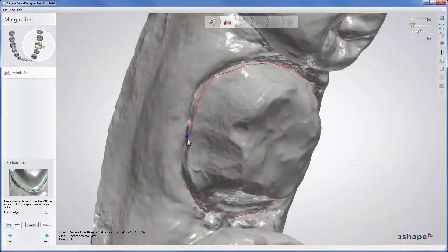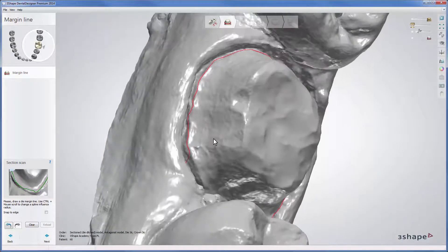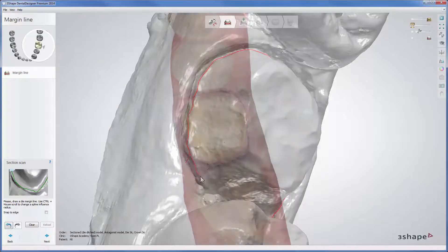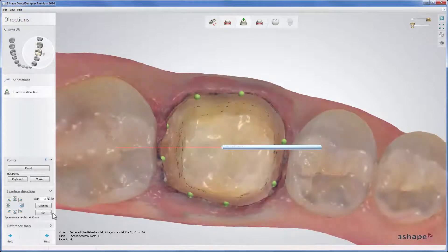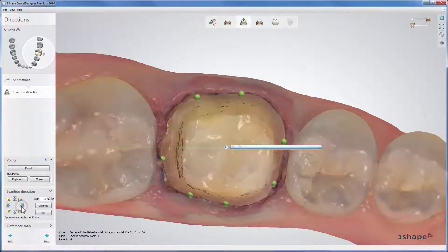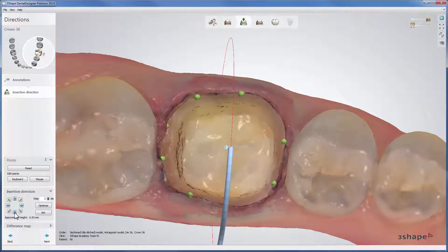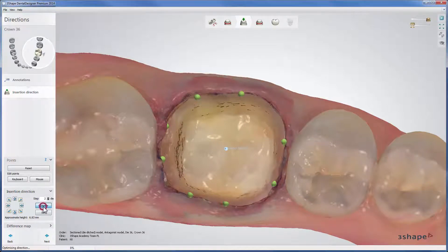You can use different color options to help with margin line setting. When done, click Next to set the insertion direction. Use the blue arrows to set the insertion direction manually from the view, or press Optimize to set it automatically.